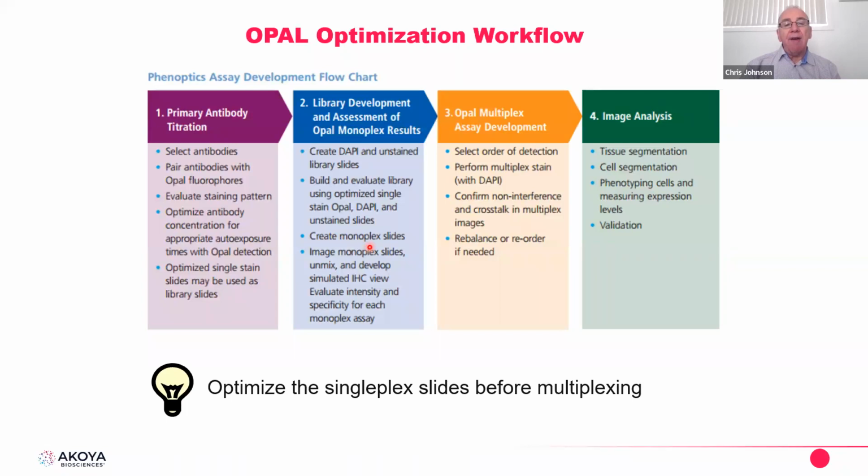So it's important to have it within the same realm as what you're going to be using it on. And with that, we can use that library to form a standard to understand the localization and the arrangement of the multiplex dyes on the sample. These days, a lot of this is done within the software itself, so the need for library development is not quite as important as it was in the past.